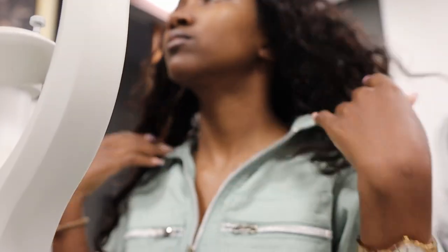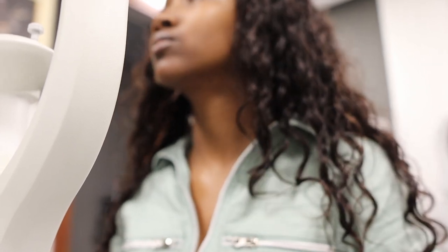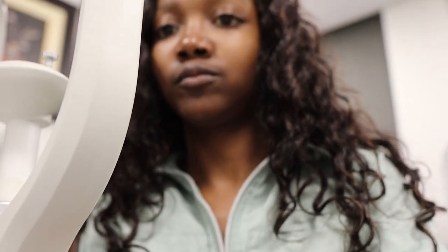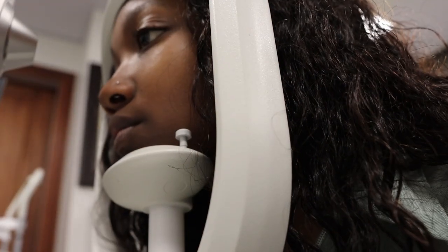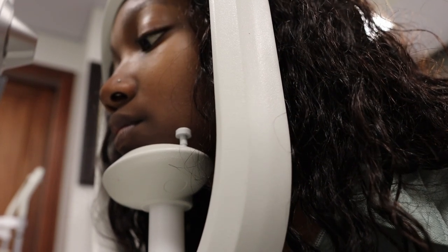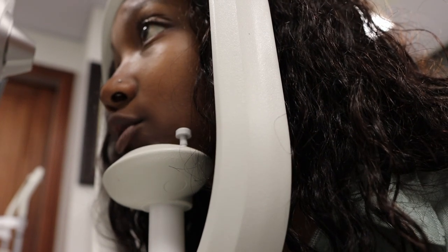I'm going to start with this one, where I'm going to get your eye pressure. So it's going to go one puff of air only to get your eye pressure and also your central corneal thickness. Cool. You can please place your chin on the chin rest when you're ready and make sure your forehead is touching the top. So we're just quickly going to check your refraction, so we can see how everything is. Yeah, you just need to repeat the one on the right eye.